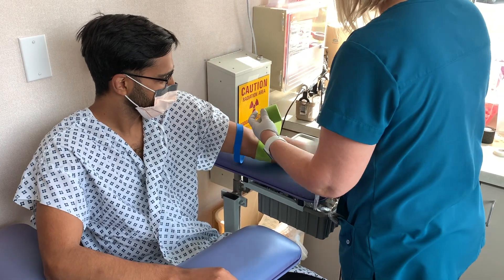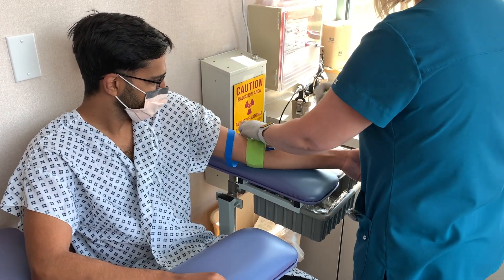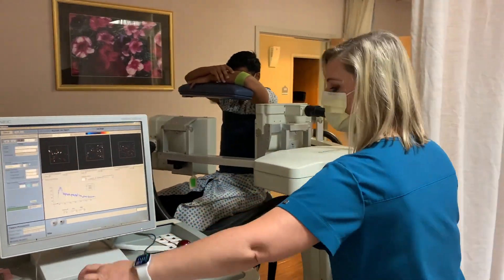You will first get an IV placed, then you will get an injection of radioactive tracer through the IV. You will get a special scan of your heart after being injected with the radioactive tracer.